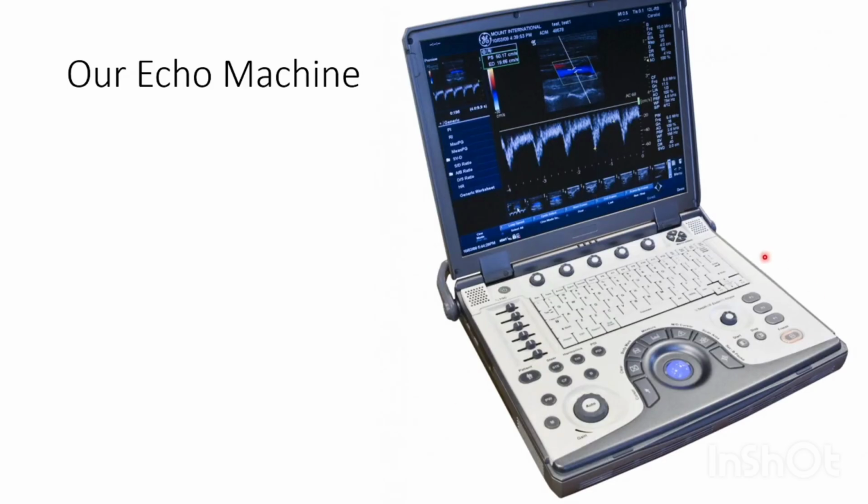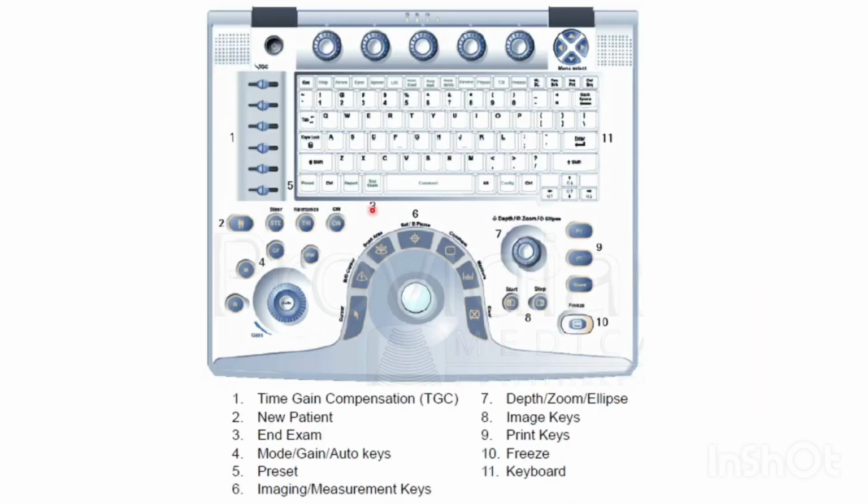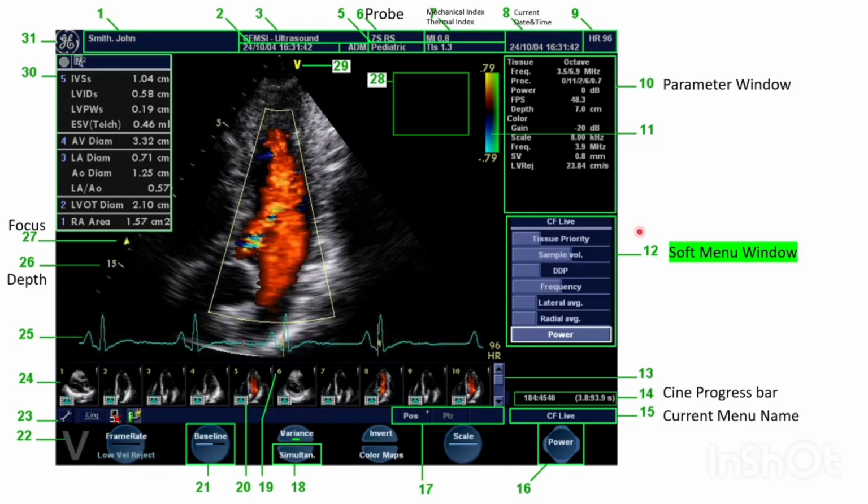This is the echo machine which we use in our CCU. It's a GE called Vivid E. This is the front panel, and I'll be discussing what each and every knob stands for and how we can optimize it. This is the front main screen of the echo machine. This is the logo. The patient name will come here, as well as the hospital name.